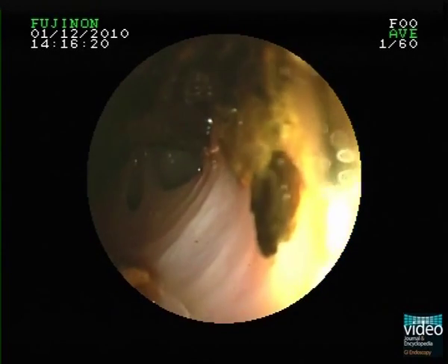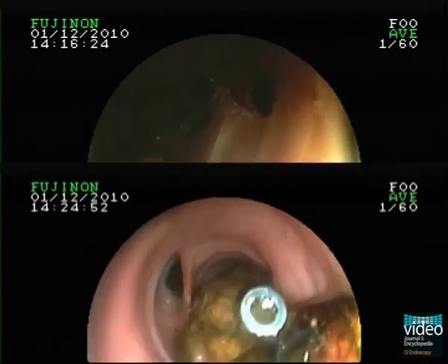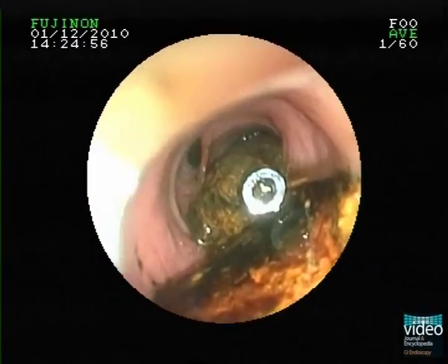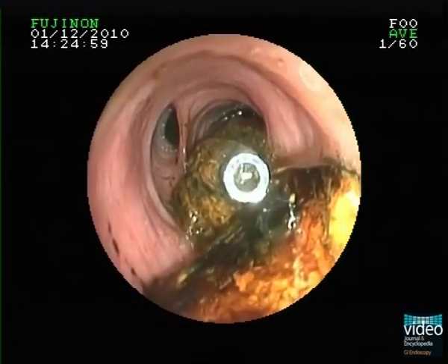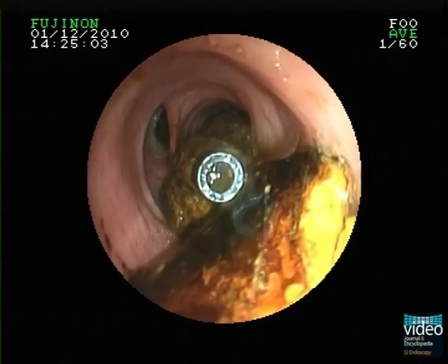Small amounts of carbon dioxide are insufflated to optimize visualization in the bile duct. We have a great view on the bifurcation and the migrated stent, which is surrounded by large amounts of sludge and residual stones.